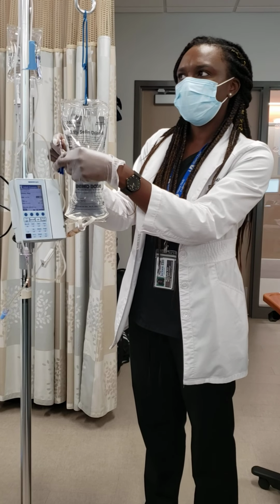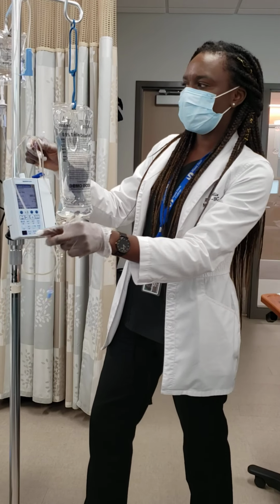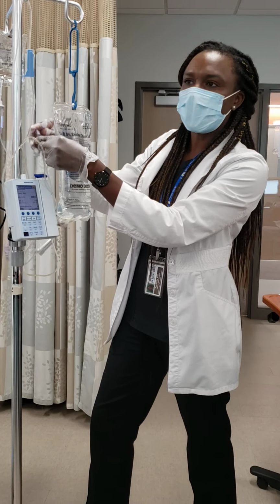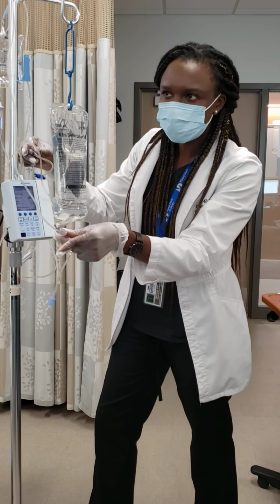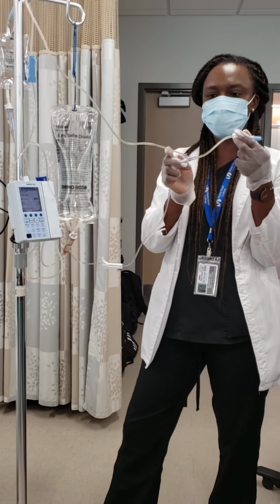it won't actually, how do you say it? I'm trying to find the right term. So if you connect it here, that means it's free flowing on its own, and the pump is not regulating. It's not going to be infusing as the pump is programmed, because it's going to be going by free flow, all right? This one goes straight directly to the one closest to the patient. So this is connected to your patient.